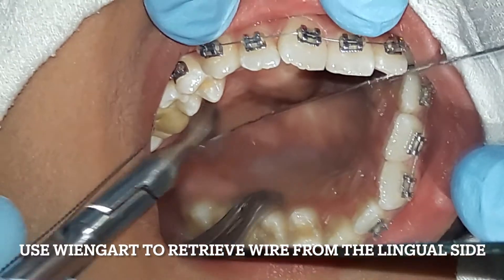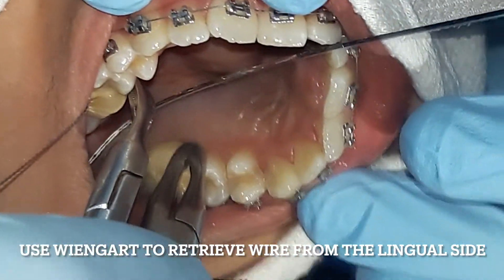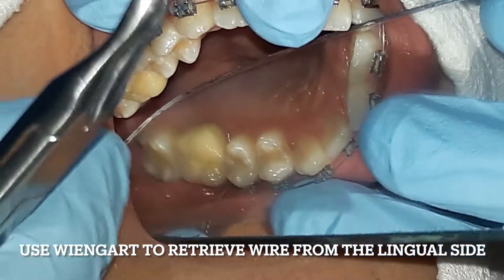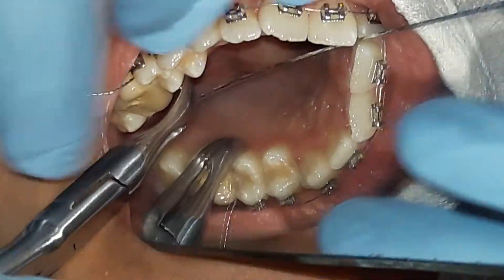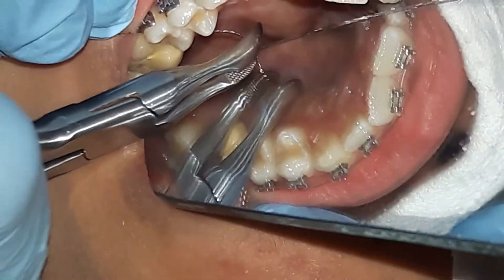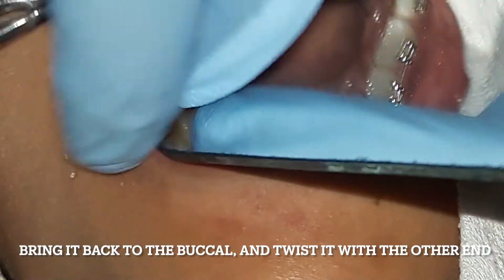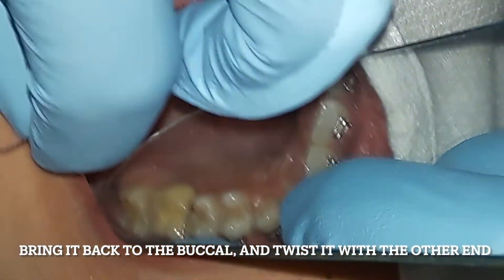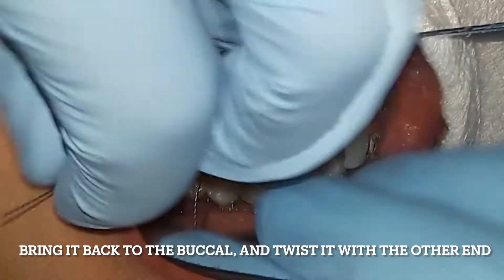With a Weingart plier, you grab the end of the wire that exits the lingual area. Gently pull the wire over the occlusal towards the buccal. Join both ends of the wire and twist until it is tight.